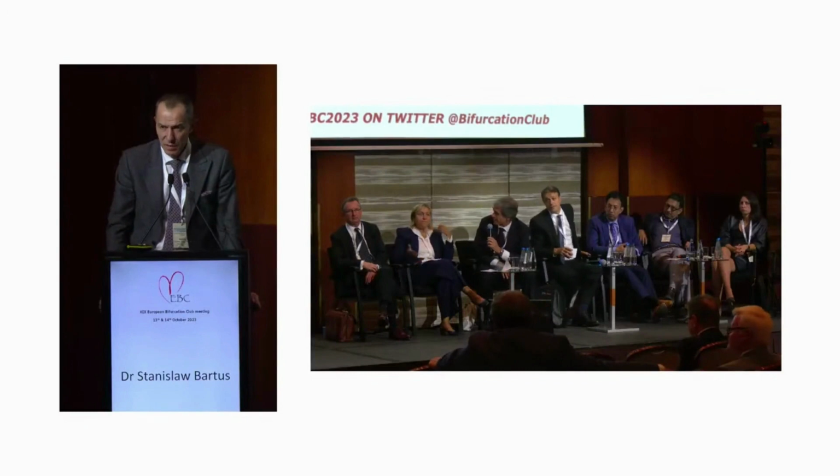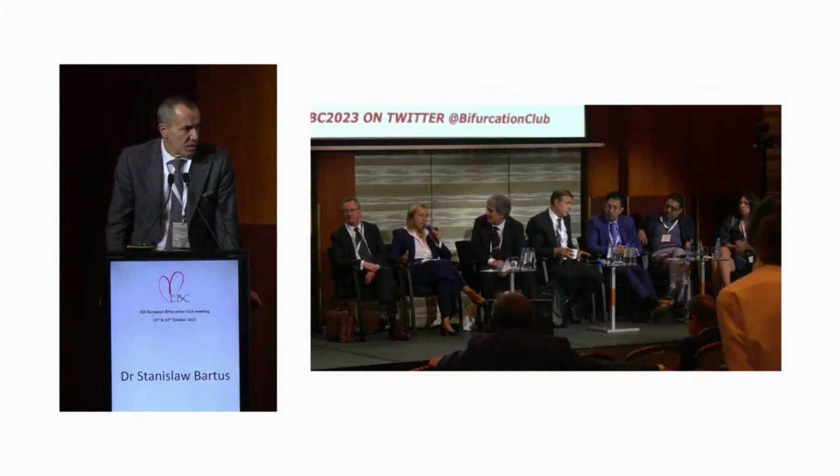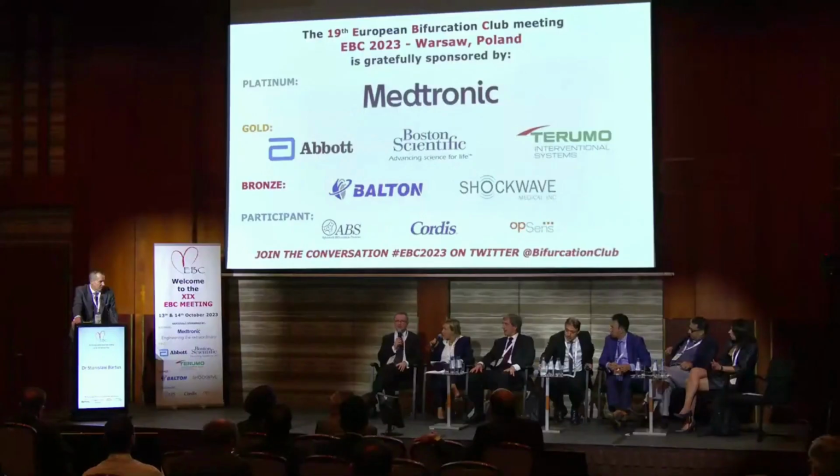The major issue was the Impella, I think. But without an Impella, this procedure could not be done. No, I mean, we cannot say it could not be done. I'm a believer, clearly, but we don't have the data that says it cannot be done. By our personal experience, we feel much more comfortable having an Impella on board, but we cannot say it can or cannot be done. The randomized study, PROTECT 4, is ongoing, so we will have data in the future.